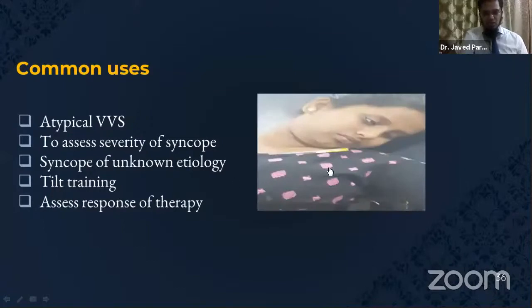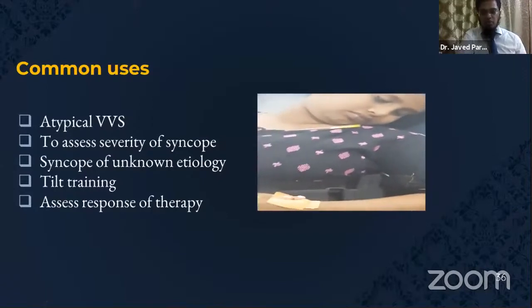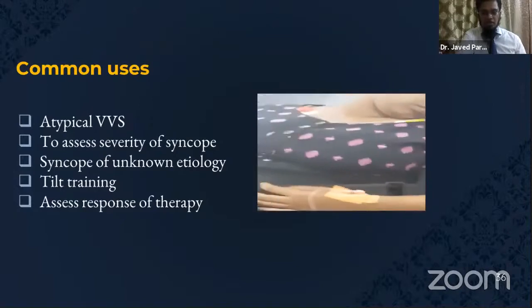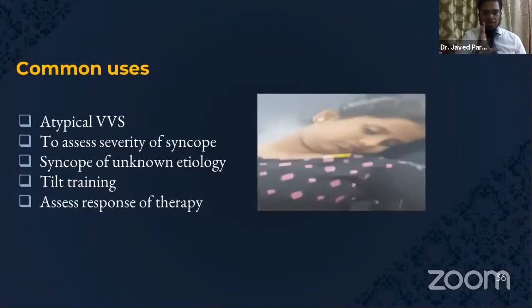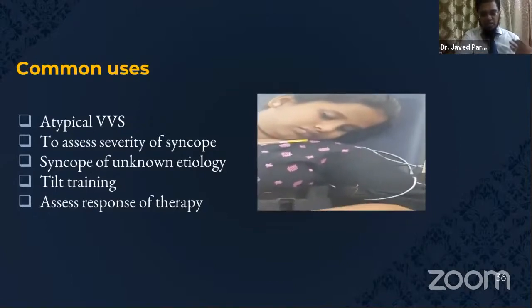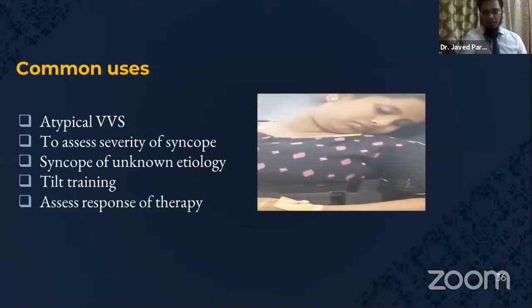This is one of our patients, a young female, who was having multiple episodes of syncope, was diagnosed as epilepsy, and started on anti-epileptic medications. This is during tilt table testing. You can see in the tilted up position, the patient is unconscious. And the characteristic sign is that as soon as you make the patient lie down, within 20 seconds, there is recovery of consciousness.